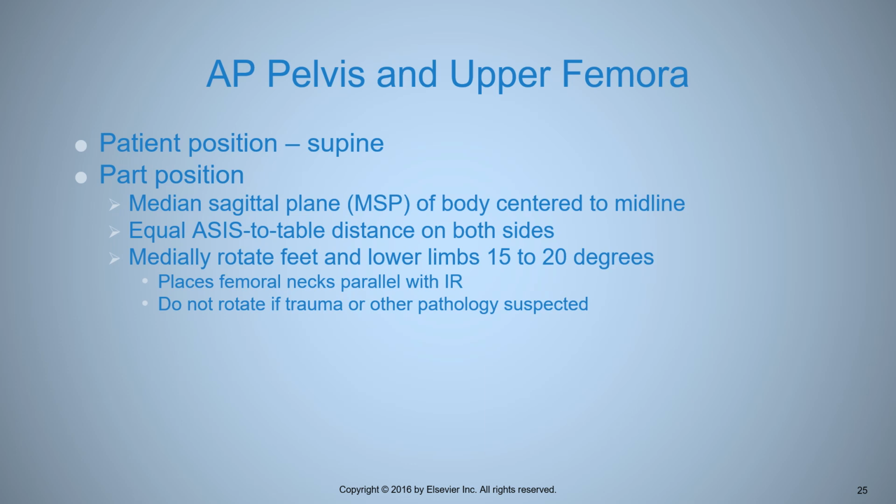Okay. To make sure the pelvis isn't rotated, people will have good hips and bad hips, especially as they get older. And so when you tell them to lay down, but you're not specific about it, they are going to lean to the good hip, the one that feels more comfortable to lay on. Okay, so you will have to square them up.